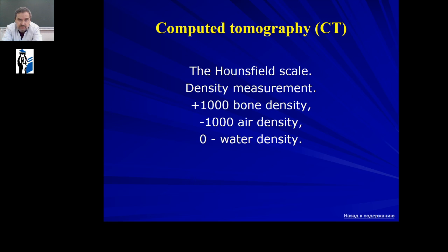There is Hounsfield scale, and between plus 1000 and minus 1000, all anatomic organs and all pathological foci are situated.